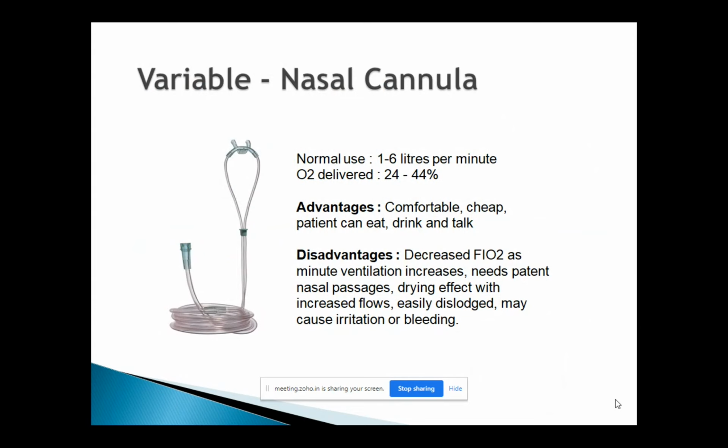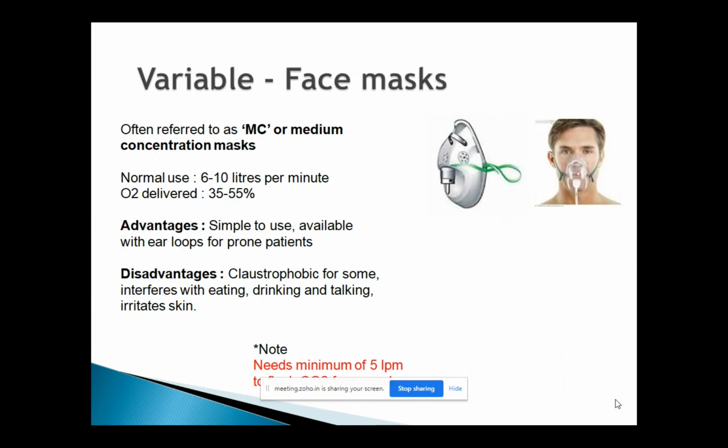So you've got advantages and you've also got disadvantages. But the important thing to understand is the nasal cannula is a variable oxygen delivery system. You can tell only how many liters of oxygen the patient is getting. You cannot assure and say the patient is achieving this much percentage of oxygen. Let's see another variable device. But the important thing to know about your nasal cannula, you can give only from 1 liter to a maximum of 6 liters. Anything more than 6 liters can cause significant irritation to the nasal passage and can cause significant bleeding, and the patient wouldn't be comfortable.